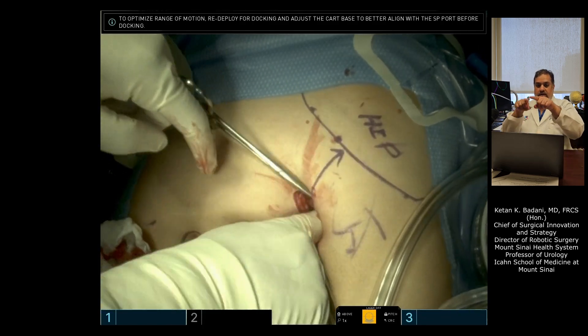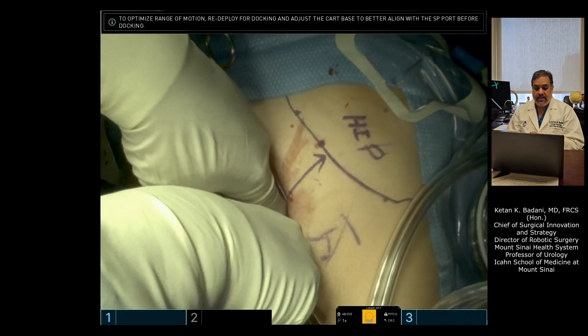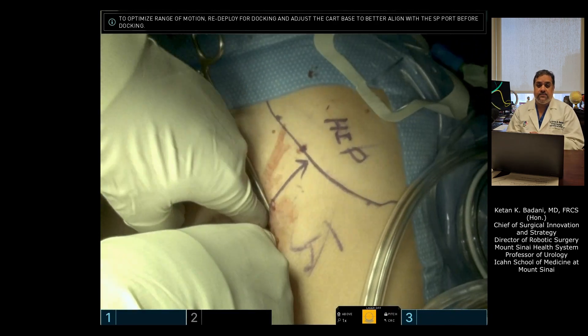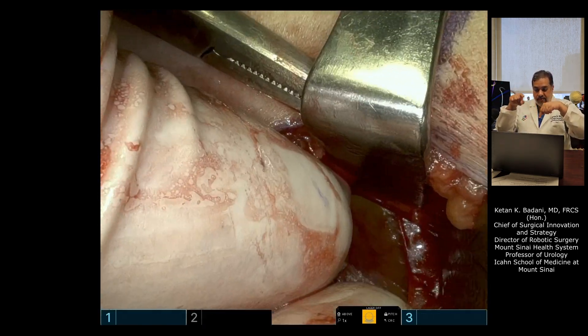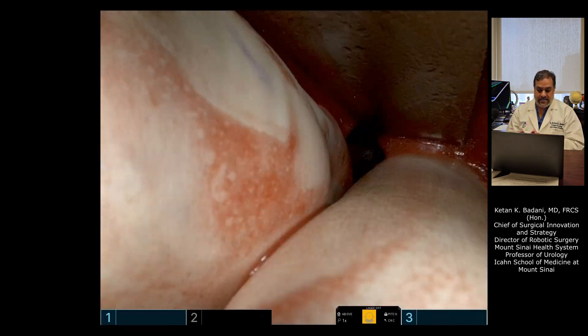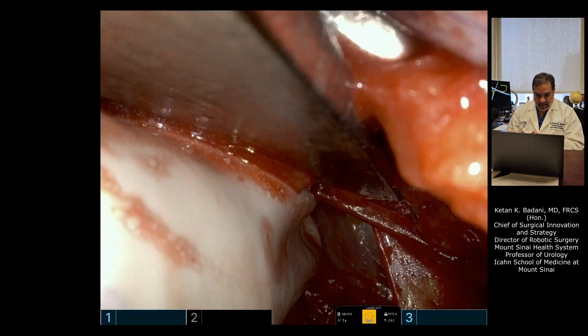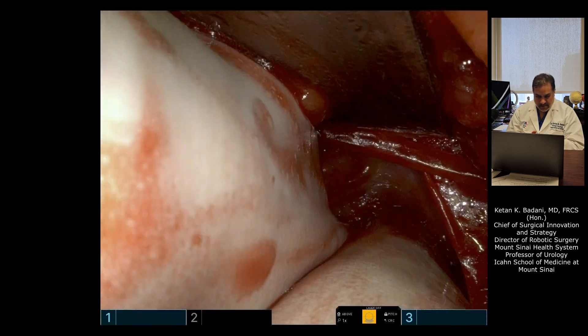Get your second finger in and roll it. Essentially what you're feeling for is the psoas muscle — you should feel it right underneath you. As you're pulling the peritoneum medially, you should be feeling the psoas muscle, and that's really all you need to do from an access standpoint. If you look inside, you see me pulling all of that fat and peritoneum medially, and there's the psoas muscle.